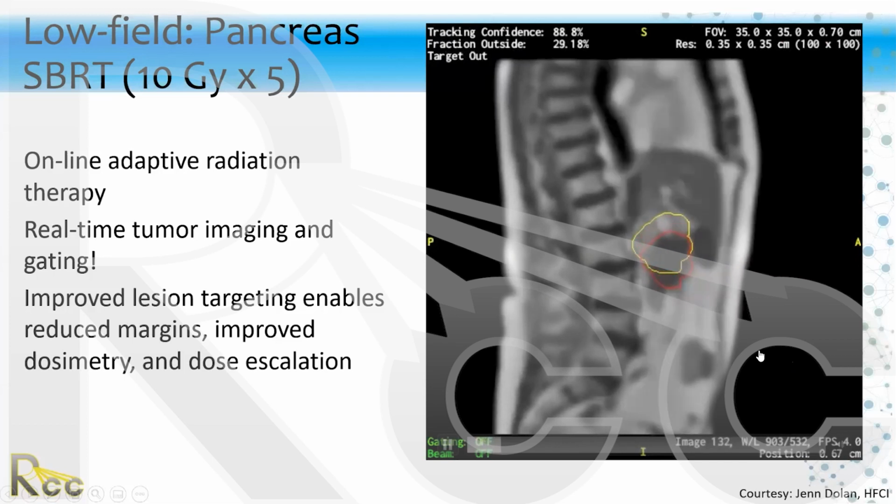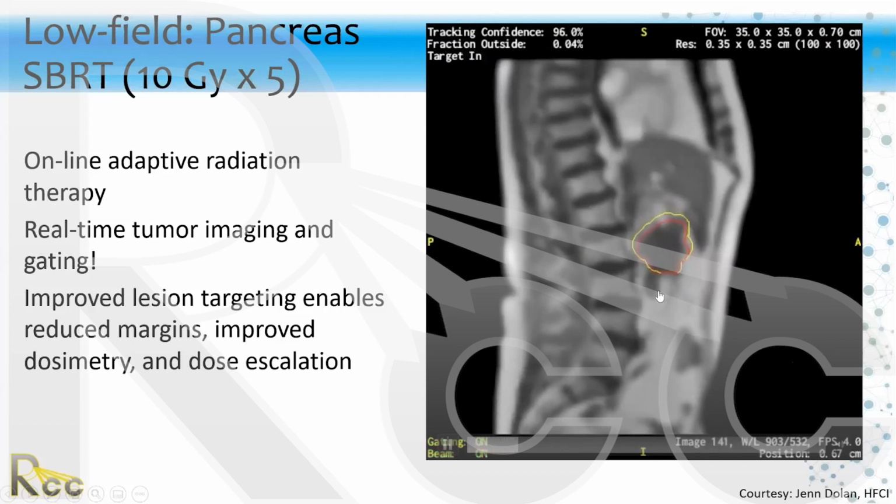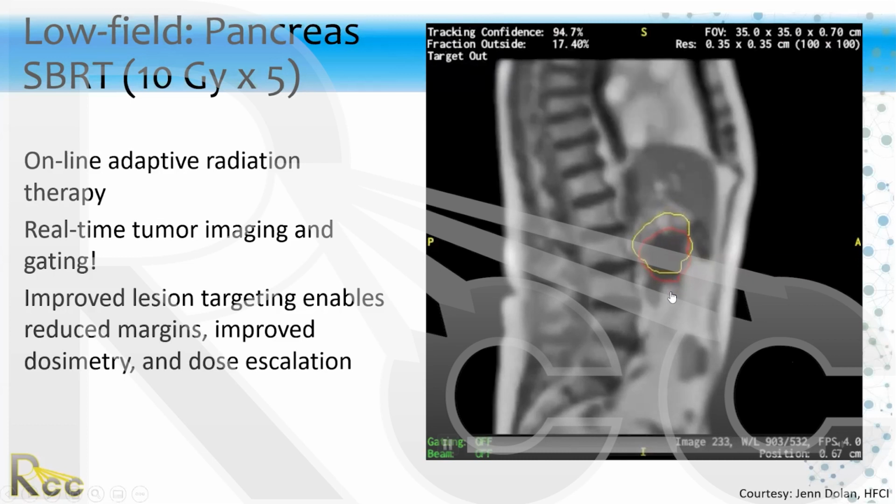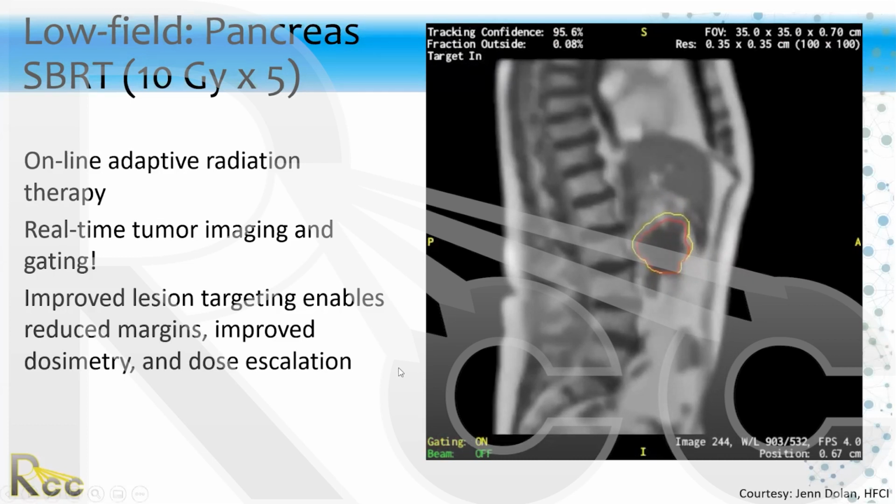Here's that same patient, and here's how we treat this. You can see the yellow line being the safety margin. When the tumor exceeds that, the radiation stops. When it's within that safety margin boundary, the beam is on. The patient is now in a breath hold position, but you'll see in a second, when we give them a break to breathe, how it moves out. It's a really great surrogate because you can actually see the tumor with MRI cine imaging. And remember, you don't have to worry about dose with MRI because it's non-ionizing.